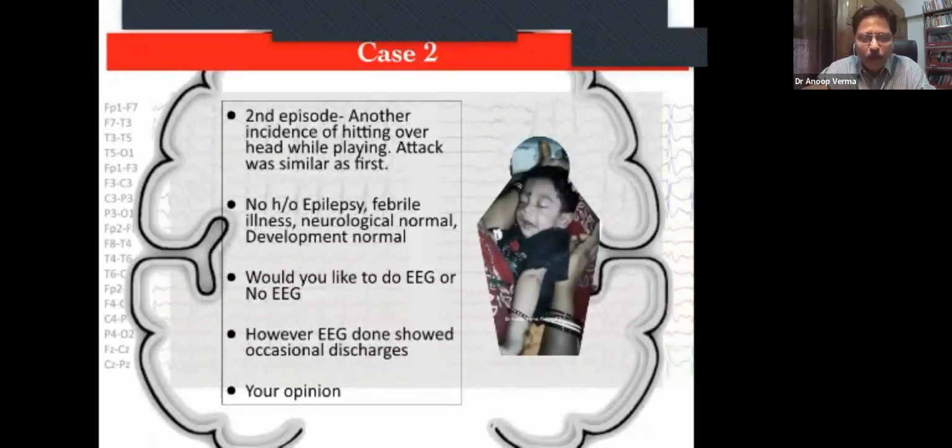So would you like to do an EEG? The video is in front of you. She presented with a tonic spasm, but definitely there was a provocation; it was a breath-holding spell. So the history is very important, and if the patient brings a video, that clarifies that you are not dealing with a seizure event. But suppose the child presents without any information or video, and the parent says there is a tonic spasm with no history of banging and so on, then one has to think along different lines.